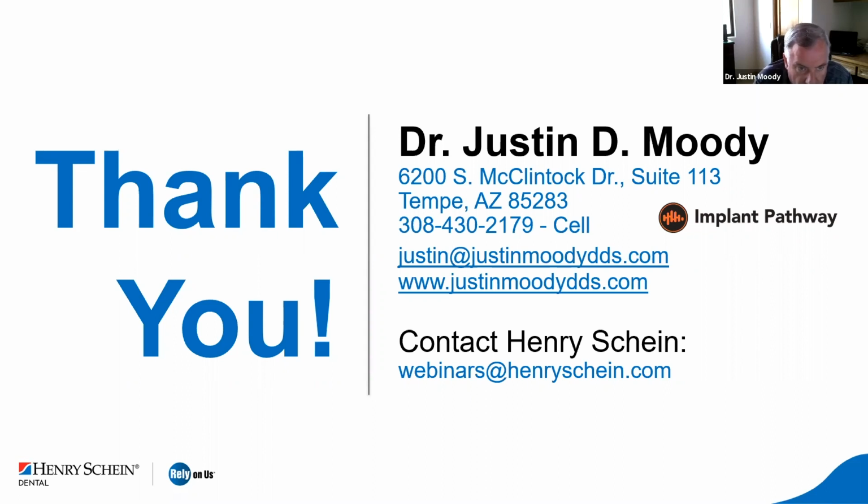You can import a DCM from another unit and create the CAD/CAM guide. The software creates an STL file, which can just be printed on anything. So there are some compatibility issues with all those. But again, someone who's done a lot of these, like my team with August and Steve Vorholt and Chris Epperson, they can make all this stuff talk to each other and so forth.